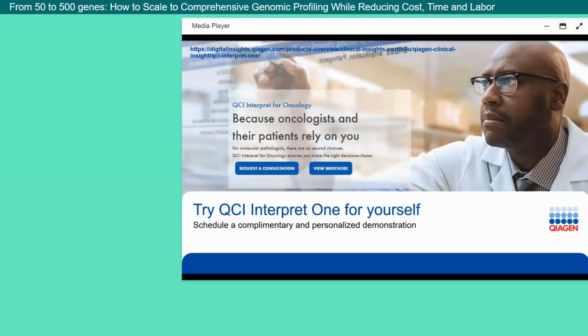So, for example, if you open up the review and report page of a final report that was maybe final half a year ago, and you reopen it, you could see that QCI would potentially gray out specific clinical trials that are not applicable anymore. And you can see what you have previously classified and how you have previously classified the variant.